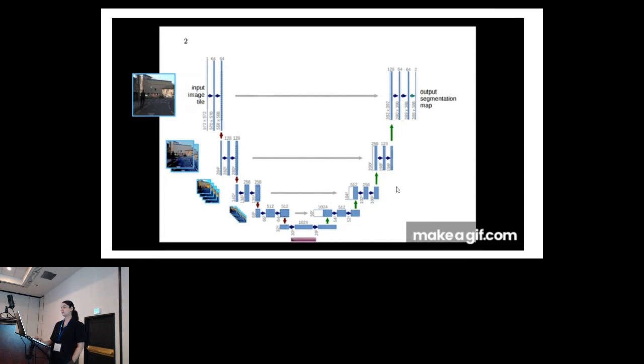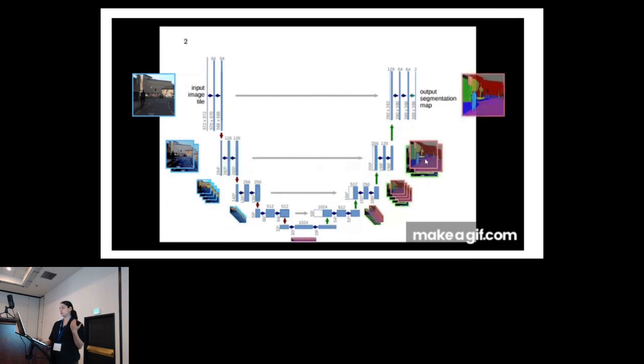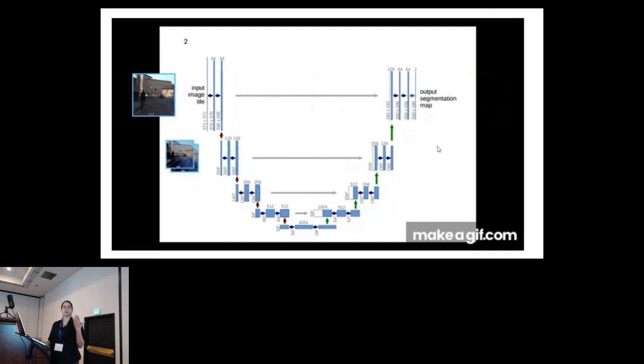It's going to overlay the image with the mask that we provided, and it's going to see, okay, this was the image, and I've detected the edges. I've detected that these are the pixels which can tell me that it's a cat or a dog or a man, and it gives us a segmentation map. So that's what a 3D UNet model is.